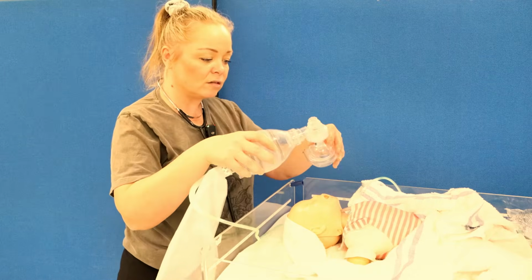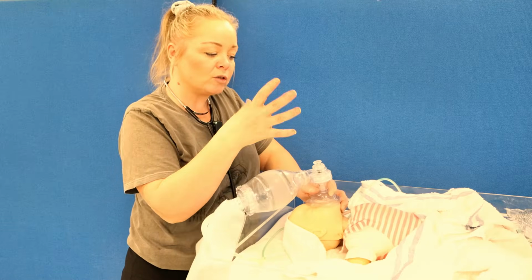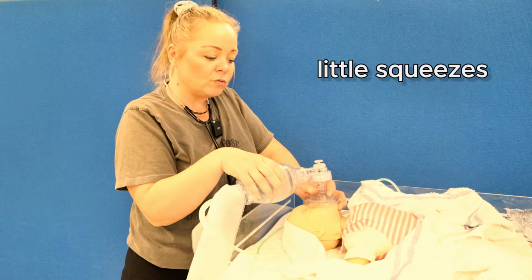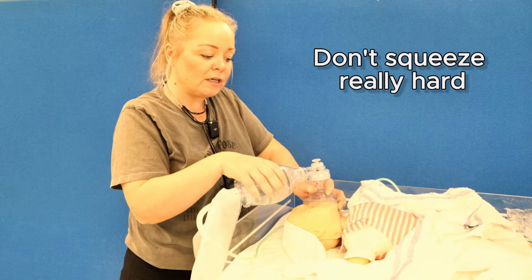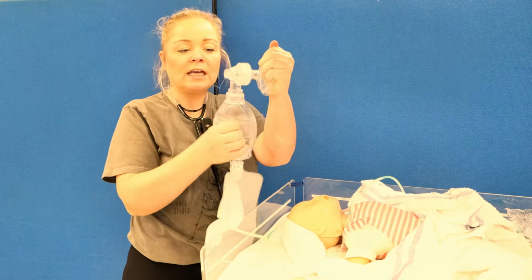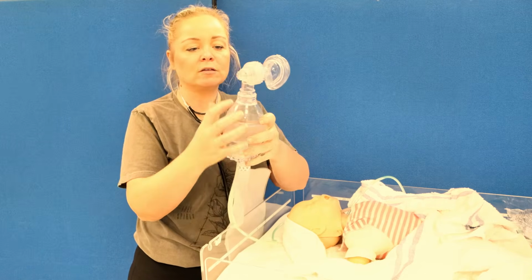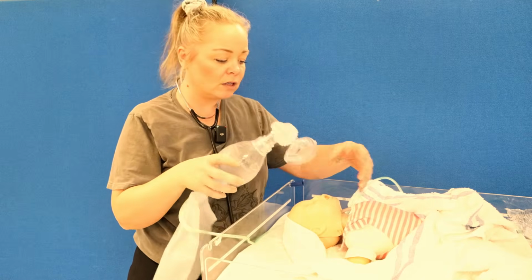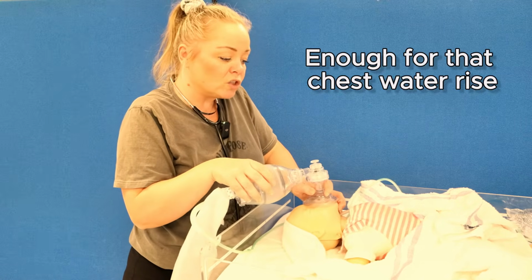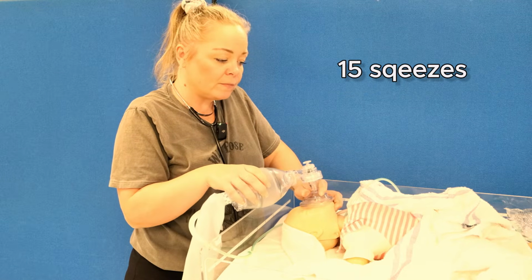So the ventilation, the mask is going to be in the same position, but they're going to be smaller, they're going to be shorter. Little squeezes, just enough to ventilate the lungs. We're not going to squeeze really, really hard. If you hear this in any of your breaths, it's too much. This pop-off valve basically restricts the amount of air going to the lungs so we don't cause any trauma. So just enough for that chest wall to rise. And we're going to give 15 of those.